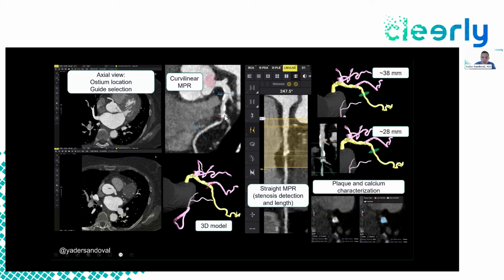As you can see here, now the most severe lesion where the tracker tool is, it's actually at a bifurcation into a decent sized diagonal. And if you don't know where you are, again, we interventionalists are not level 3 readers. You just go to the tracker tool, find that tight lesion, and now you can see in the 3D model, not only is it tight and calcific, but it's right at a large diagonal. That's an important perspective because now you're thinking maybe you want a potential 7 French guide. Maybe you want to protect that side branch with another wire.